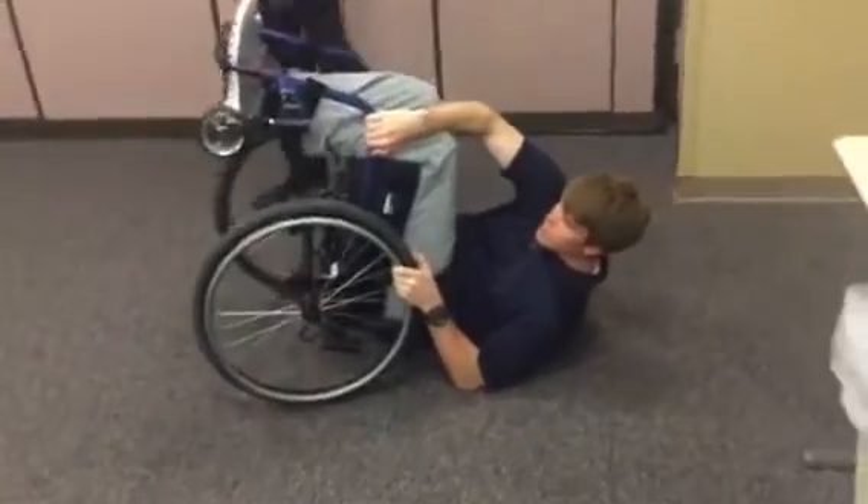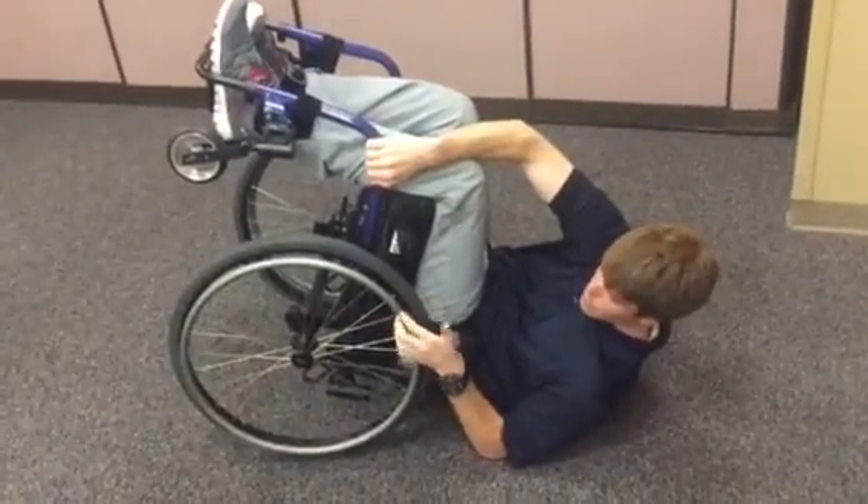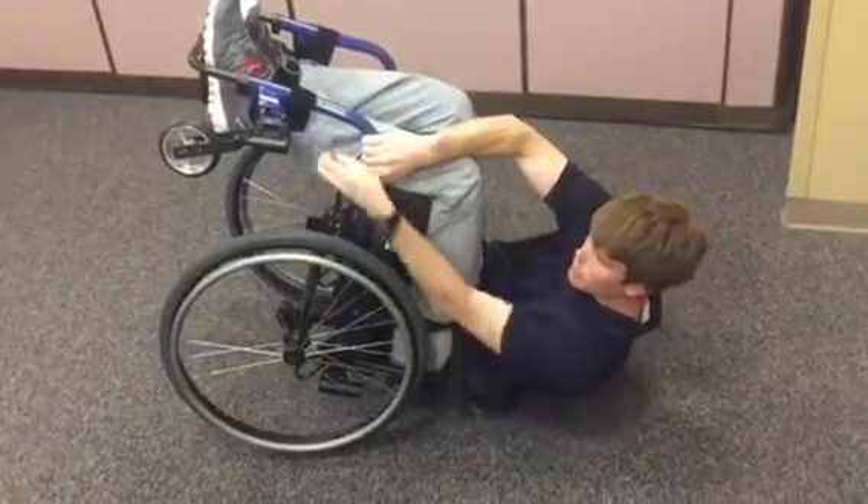Once you're in this position, you need to make sure that you're holding onto the frame. If you try to hold onto the wheels, the wheelchair will spin.